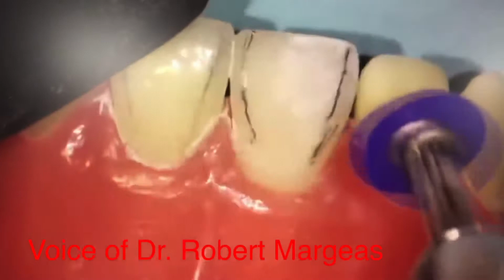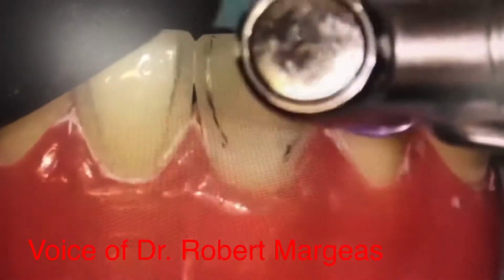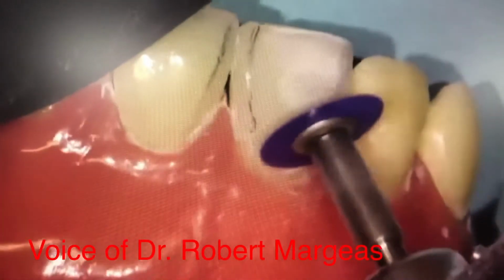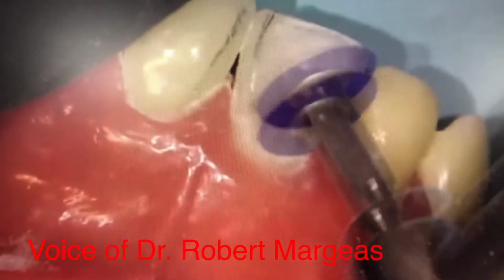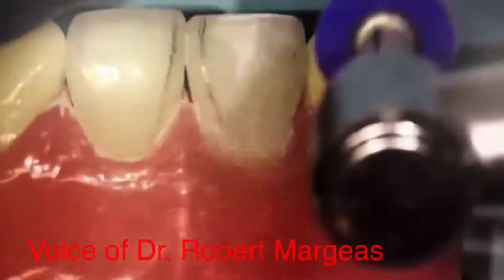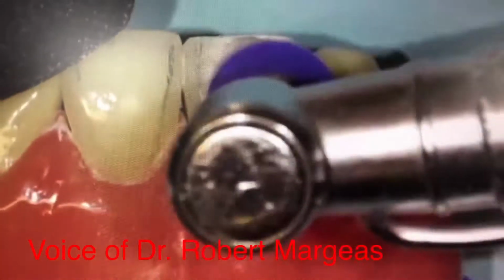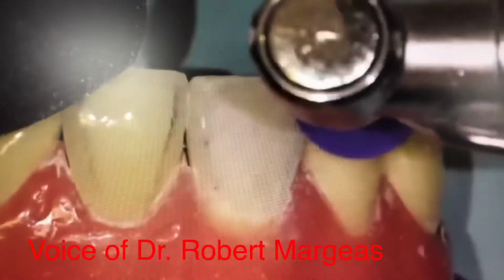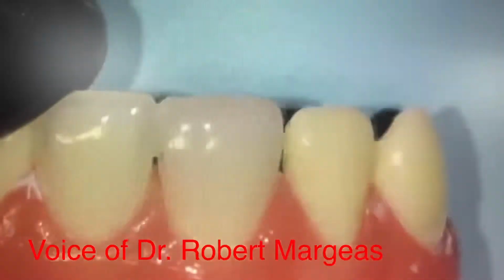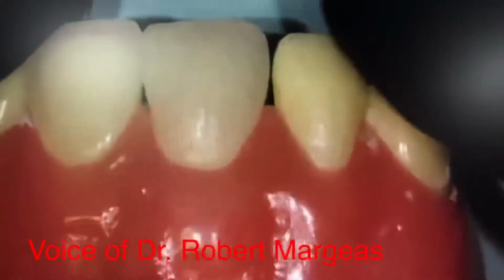So I can take my disc, and the thing about these little discs is you can work between the line angles a little easier. And I don't think we have those in the kit. We may in the future put these in because I do use these a lot. I like those little discs to work between the line angles. And then I take that off and we see what that looks like.